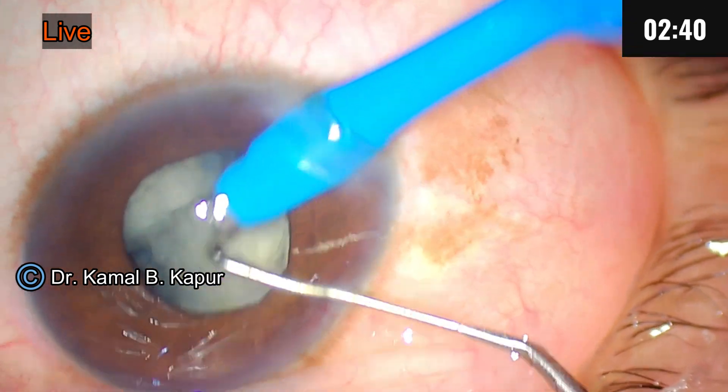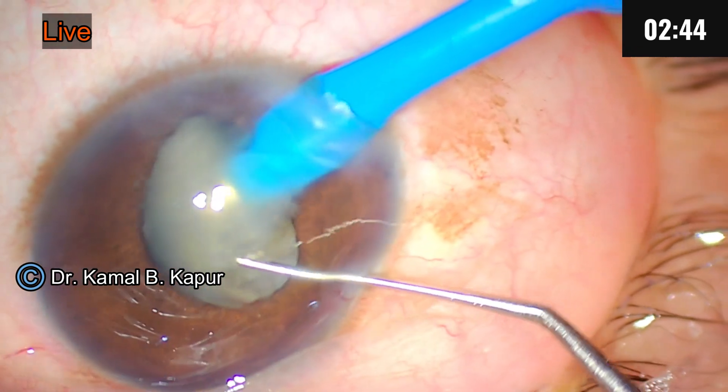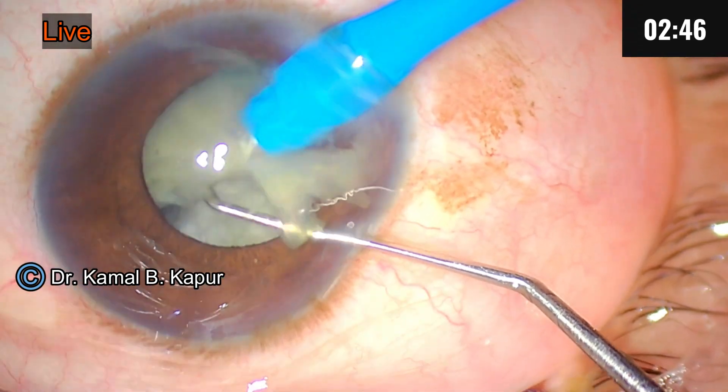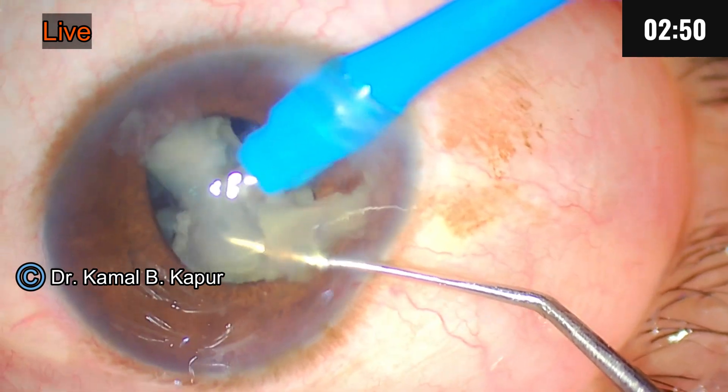Since the pupil is going down small on me, I am doing a de-flip technique. This is one of my favorite go-to techniques for small pupils — I don't need to actually go in and chop the cataract in the bag.